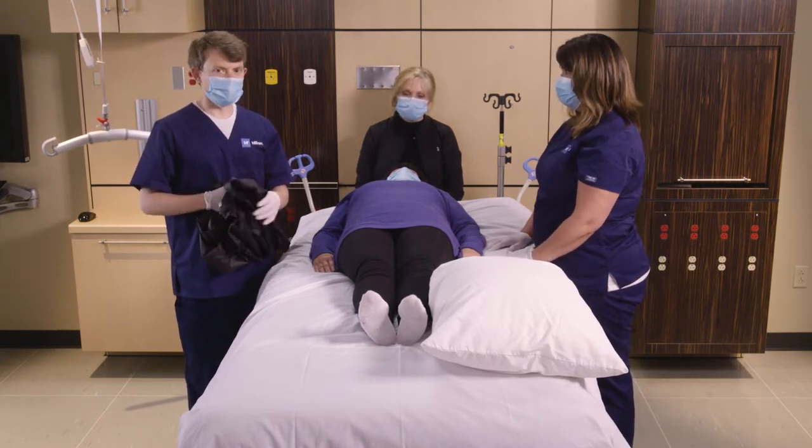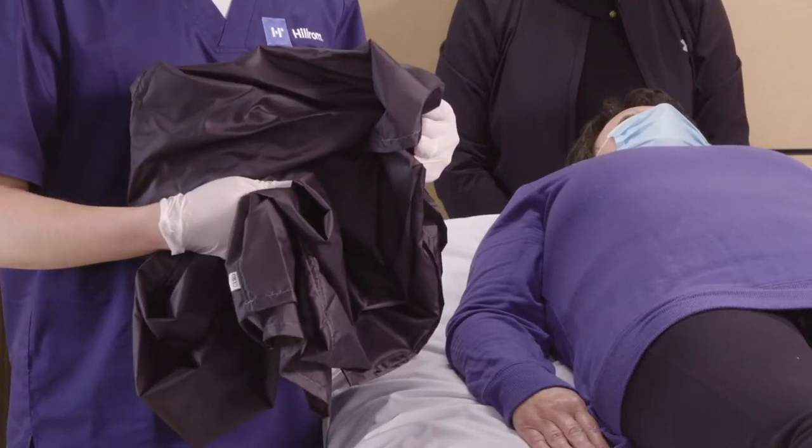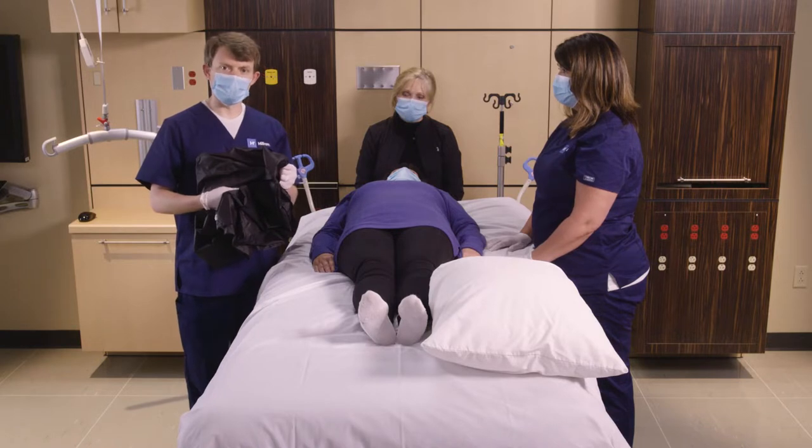The first thing we're going to do is determine the side towards which the patient's going to turn. We're going to then place the handy tube under the patient from about shoulder level to the heels.